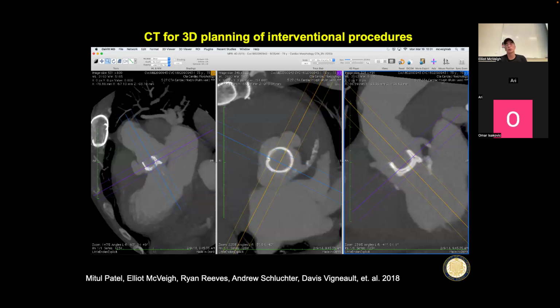Oh, this is a cool one. This is like homemade interventional planning, or we're calling an audible in this patient. So this patient had a surgical aortic valve put into their heart, right, for their aorta. However, the surgical valve didn't work that well. There's a big gap on one side, big gap on this side. And if you look at the top of the valve, you can see all of this space around it. So the blood is going around the valve, right? So it basically came off of its mount. And so there's a big hole here where blood is going.